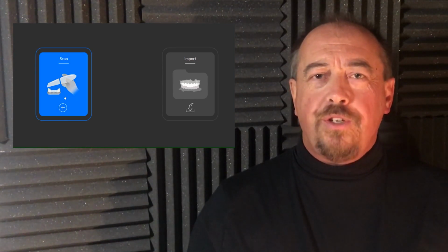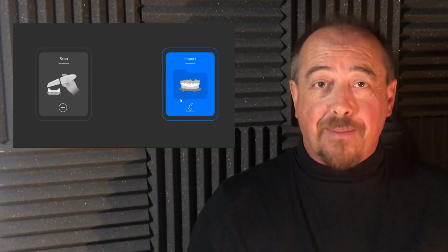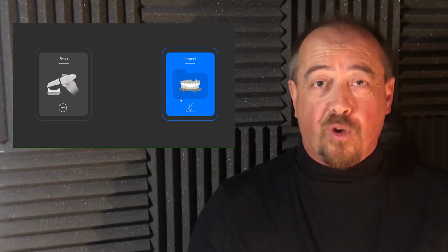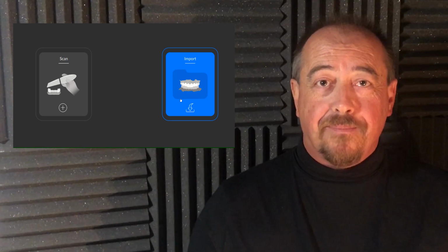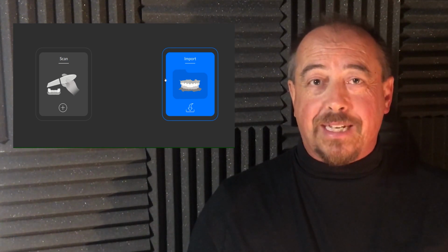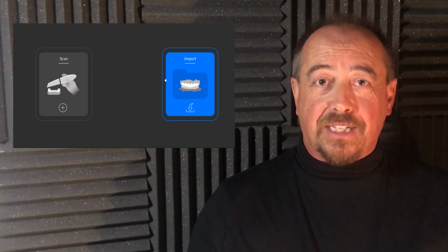So when and why would you do that? Say I come to your clinic today, you scan me, I need a crown, I'm going to come back in 2 or 3 weeks' time for a prep appointment. So you scan me today, or your nurse may scan me today. And then in 2 or 3 weeks' time, all you have to do is re-import the previous scan and stitch in your prep to that scan.